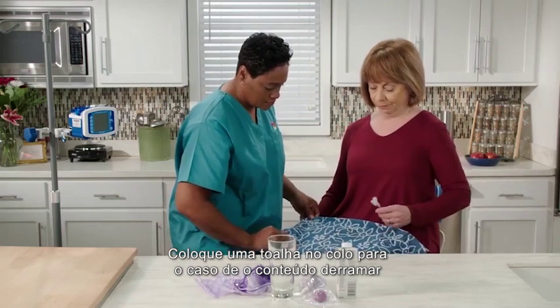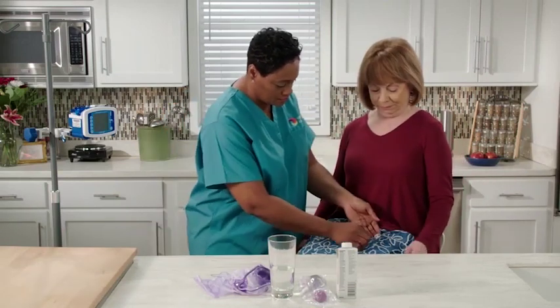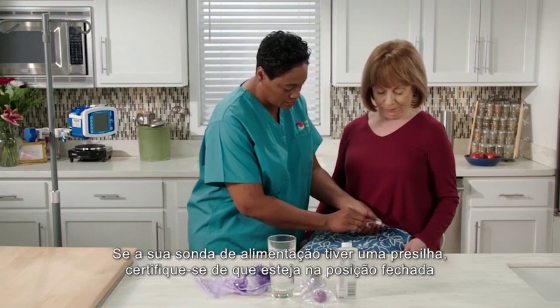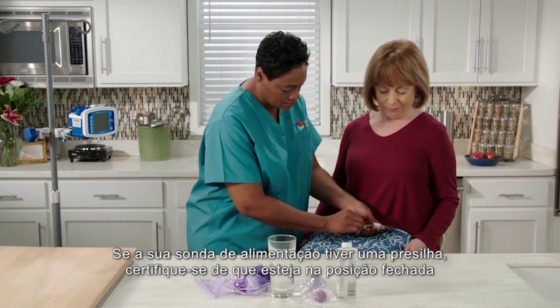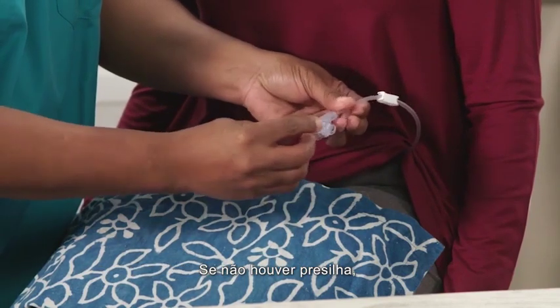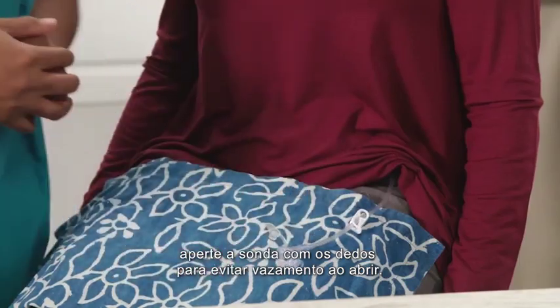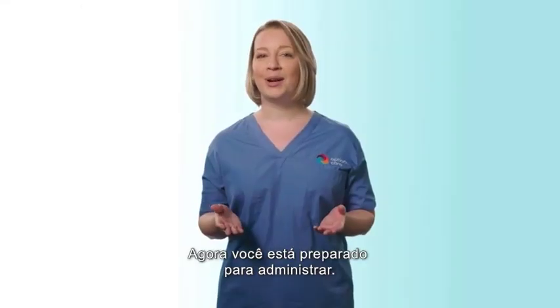Place a towel in your lap in case contents spill or your formula drips during administration. If your feeding tube has a clamp, make sure it is in the closed position before opening the end of your feeding tube. If there is not a clamp present, pinch the tube with your fingers to prevent leakage when opening. Now you're prepared to administer.